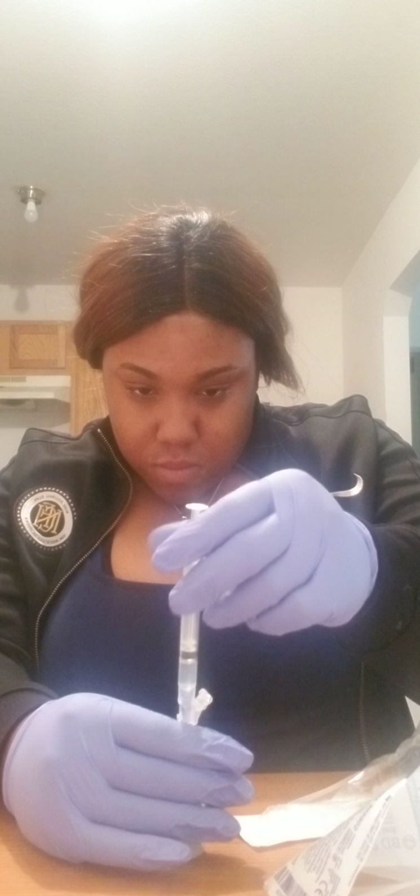This right here is my insulin needle. I will be showing you how to do insulin. Also, this is an ampule, which is a glass vial filled with medicine, insulin or different types. They also have powder and liquid, but this is what I'm going to show you how to do. Now, this right here is a 3 milliliter, 23 gauge, which we can basically start talking about.